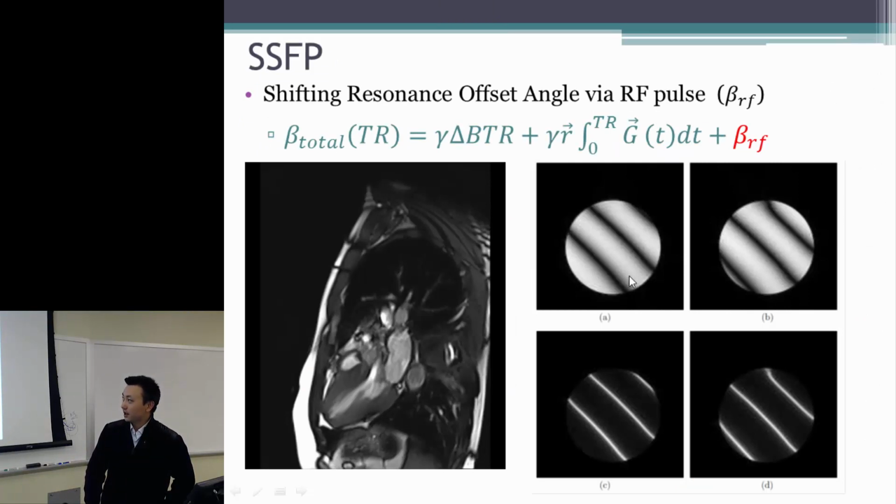And this is the high flip angle case. This is the low flip angle case. And on another, this is cardiac imaging using the SSFP. We can also see that at the edge of the imaging field of view, there are very significant field variations, because the field is not very homogeneous at the edge of this FOV.